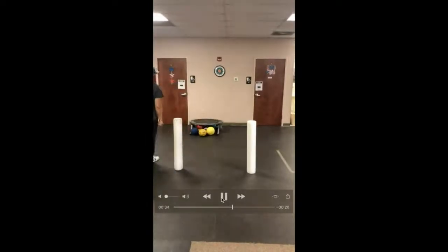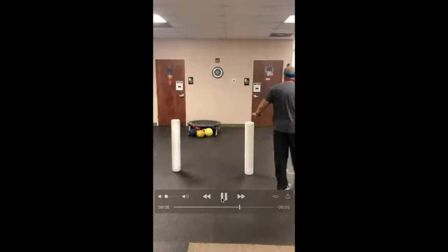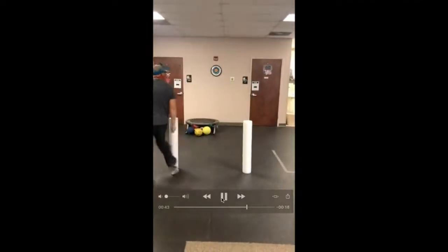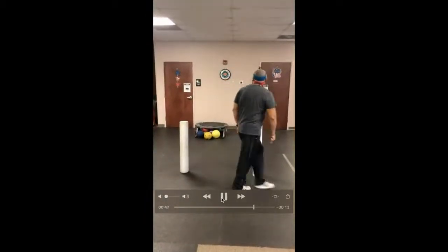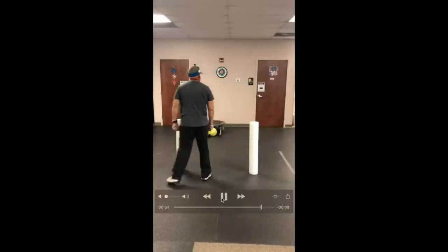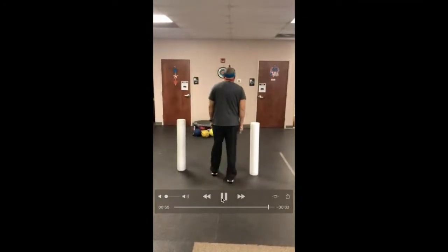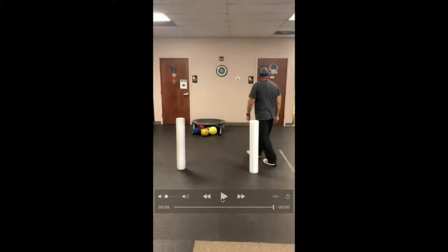He wants to look now. And if he has to back up here, that laser's really going to drop down. You see how far that went down? And he even lost his balance a little bit there as he's going around. So now we have a better indication of what we need to work on. Is he getting a peripheral vision issue over on the right side? Is that a thalamus problem that we might have to re-educate for blind spot over on that side? There's a lot of things to consider with that information, but it's definitely different going toward this right target to the left.